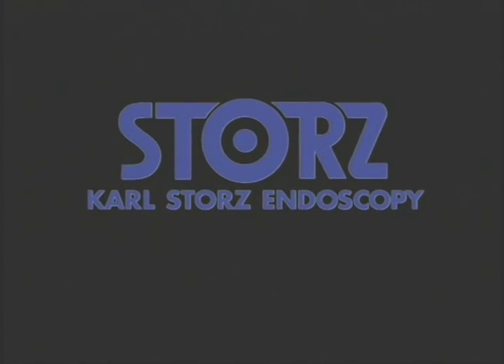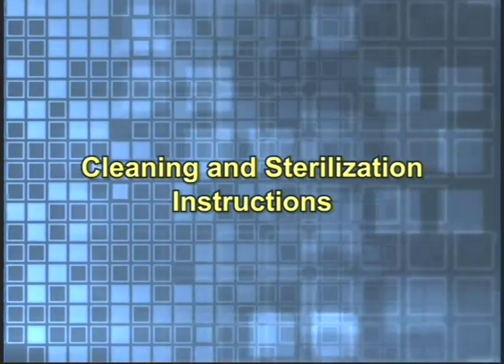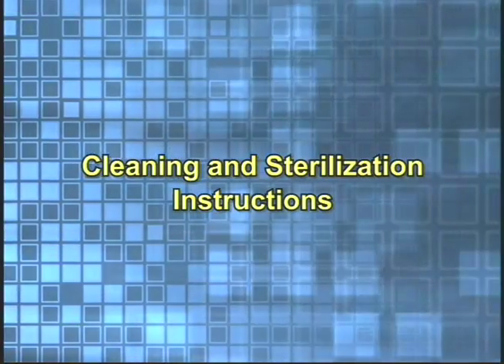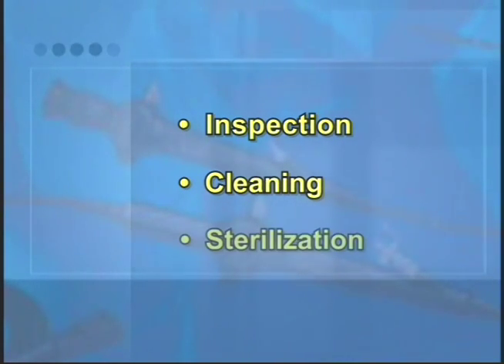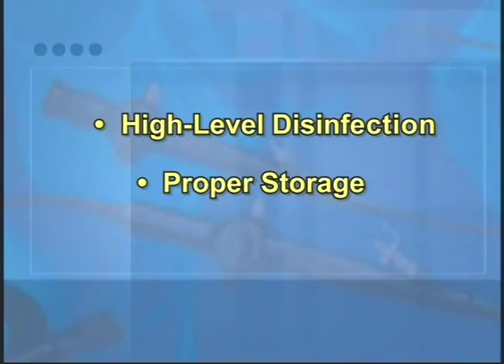Thank you for placing your confidence in the name of Karl Storz. This video is designed to assist you in the maintenance of your Karl Stortz flexible intubation scopes. This video covers inspection, cleaning and sterilization of the flexible intubation scope. It also covers high level disinfection and proper storage of the flexible intubation scope.